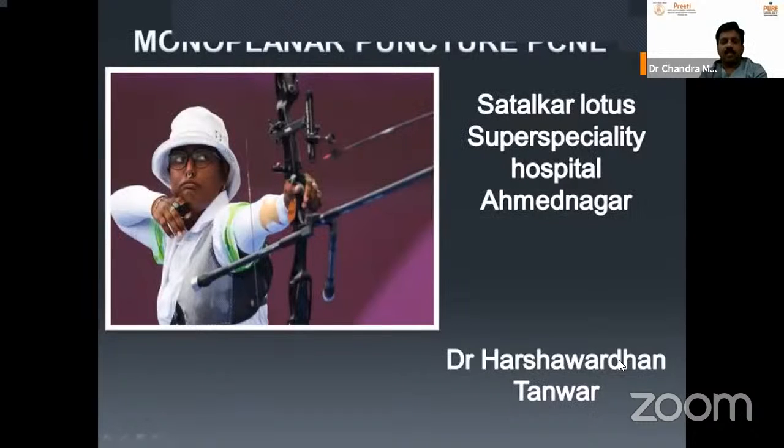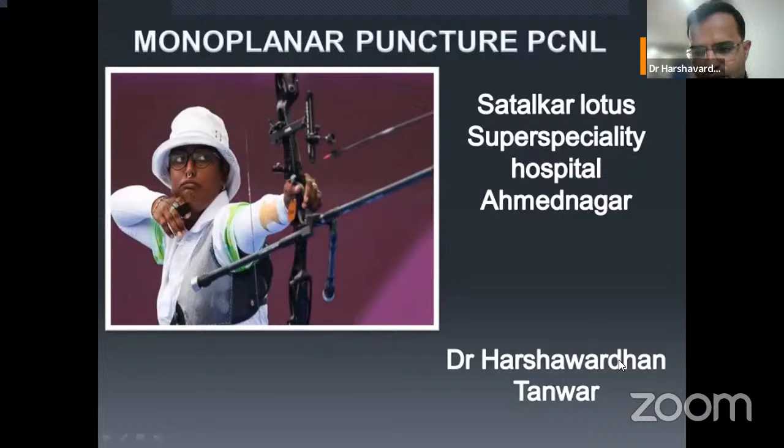Yeah, it is enlarged. Okay, go ahead. Is it visible now? Yes, yes.